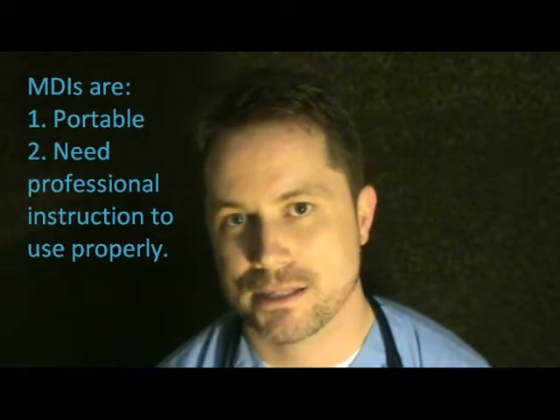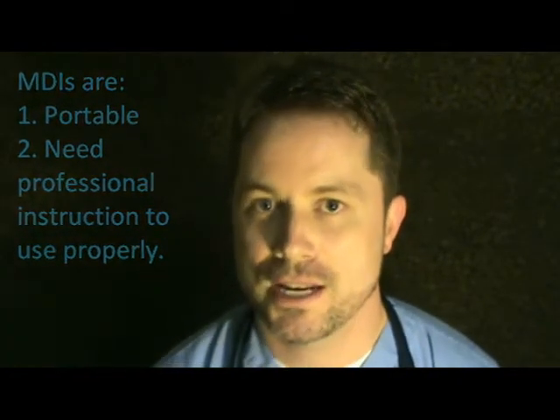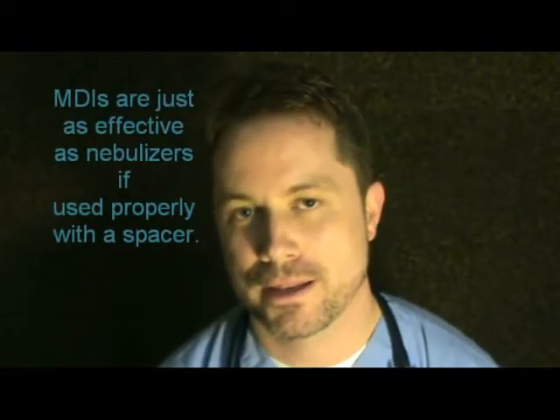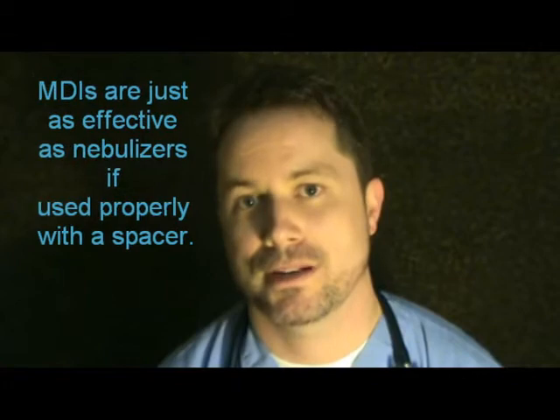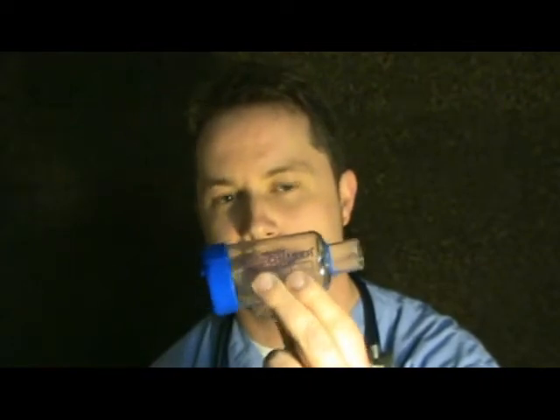But MDIs need a little bit of skill to use. You need to be taught how to use it properly. MDIs are just as effective as nebulizers if you know how to use them properly and you use a spacer device. A spacer device looks like that. What a spacer does is basically capture the medication and let a flow of air carry the medication down into your lungs, to where it actually gets there and can open your airways up.